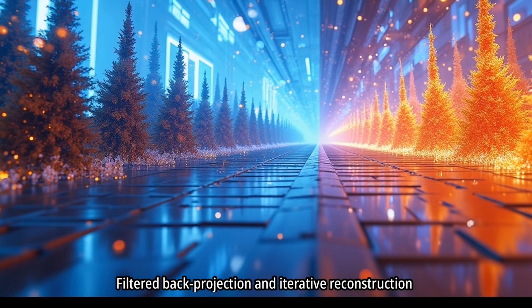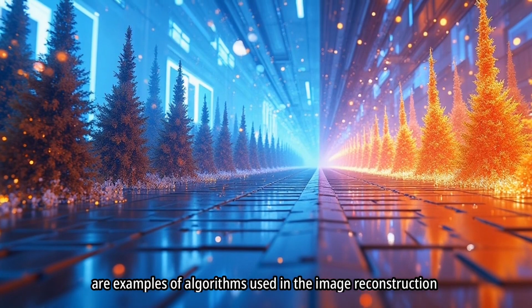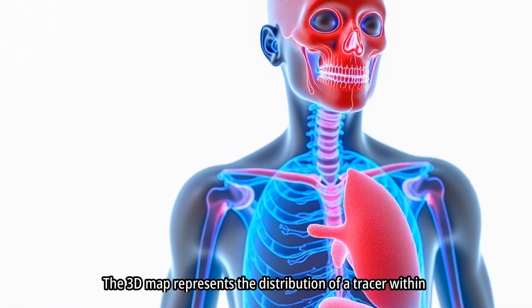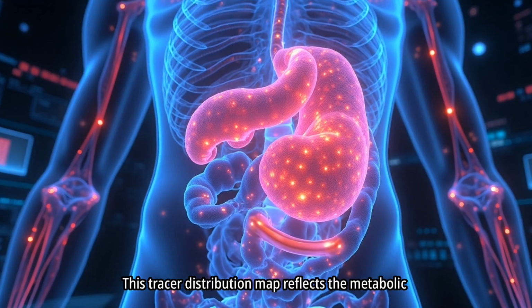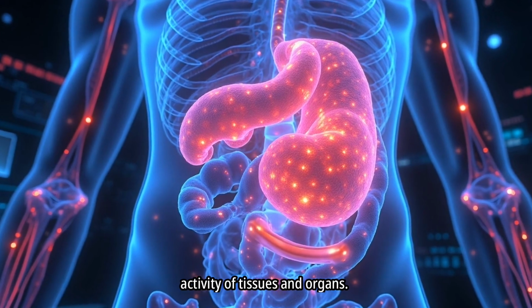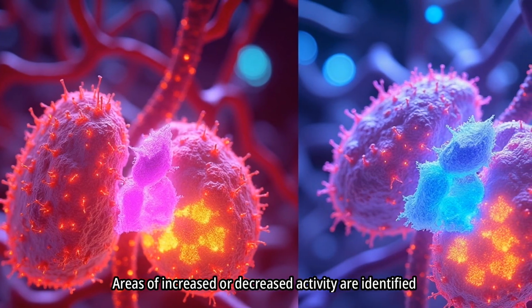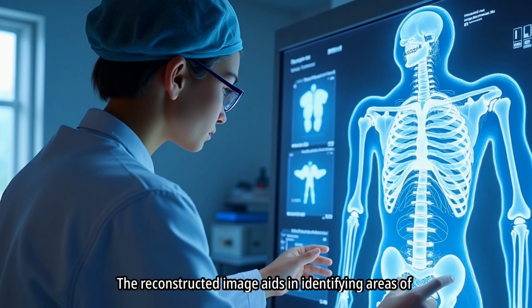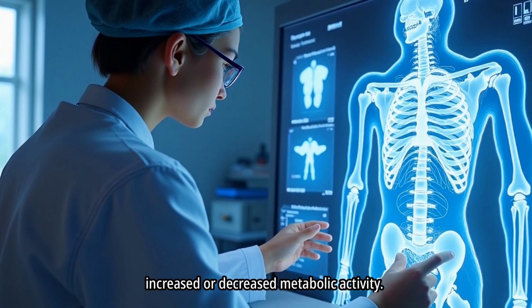Filtered back projection and iterative reconstruction are examples of algorithms used in the image reconstruction process. The 3D map represents the distribution of a tracer within the body. This tracer distribution map reflects the metabolic activity of tissues and organs. Areas of increased or decreased activity are identified through the reconstructed 3D map. The reconstructed image aids in identifying areas of increased or decreased metabolic activity.